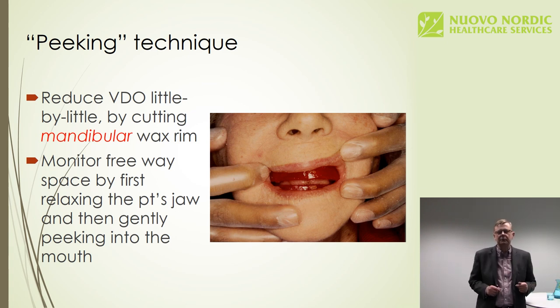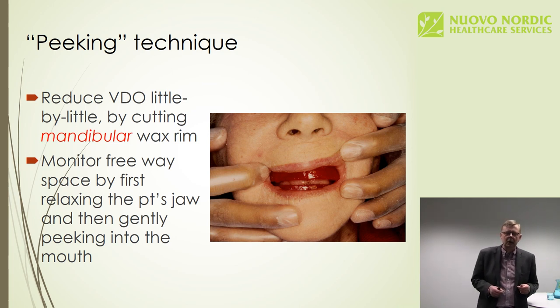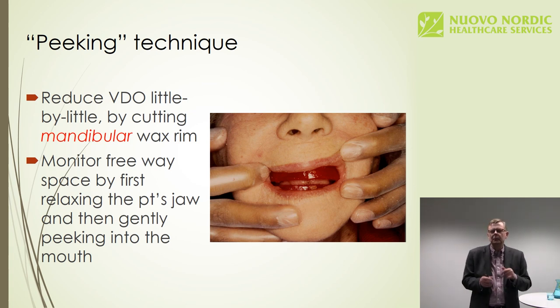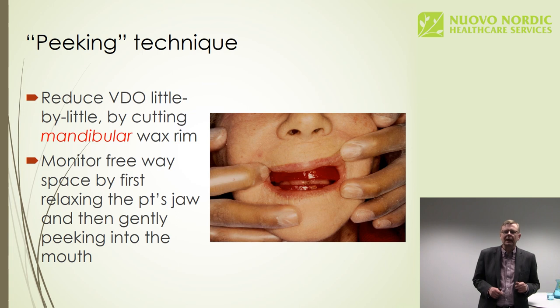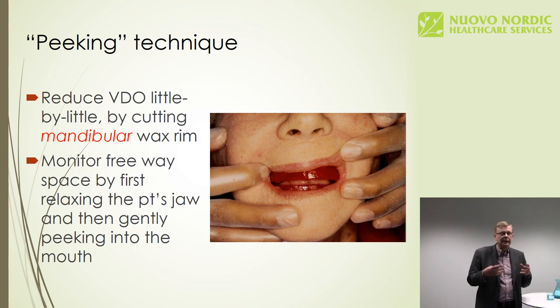I just make the patient relax, and then at some point I say that now I'll just peek into your mouth, and try not to move your lower jaw. And then, as we have done it a couple of times, perhaps we'll be able to see the relaxed jaw and the freeway space. So this means anyway that you have to become familiar. You have to come to know the patient. You have to become pals. The patient has to tolerate your touch. You will massage the muscles a little bit, try to relax the patient.